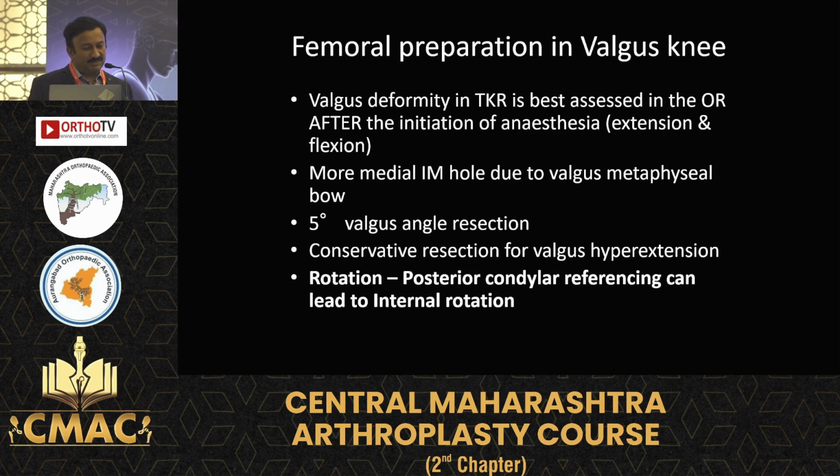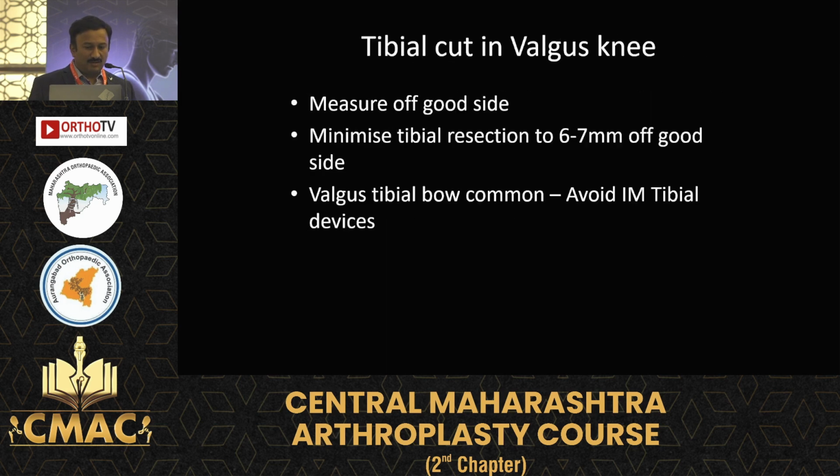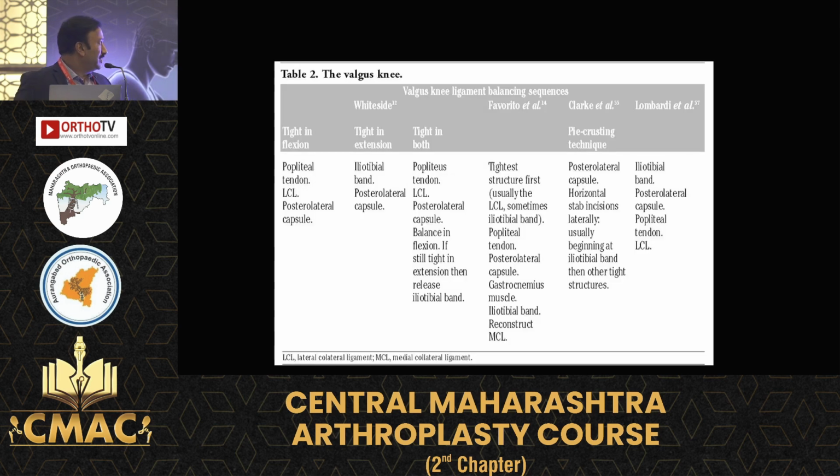Posterior condylar referencing can lead to internal rotation. I normally use anterior referencing. I mentioned all these points, and make sure that you avoid intramedullary tibial devices when you take a tibial cut. If you see the literature, different techniques are mentioned by Leo Whiteside, and then Dr. Ranawat, they have mentioned different techniques.